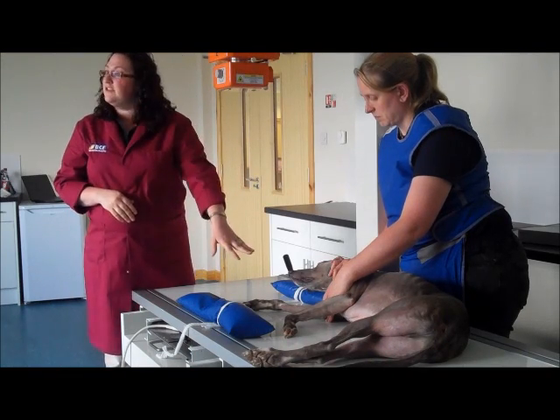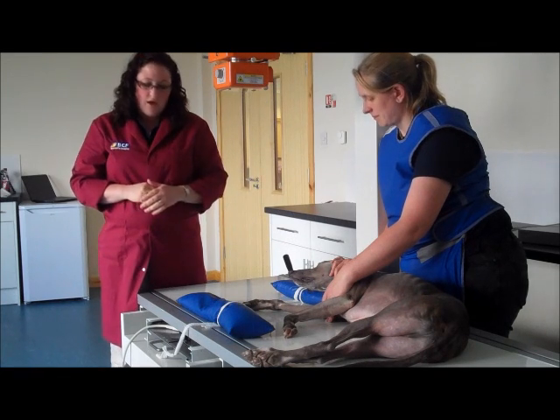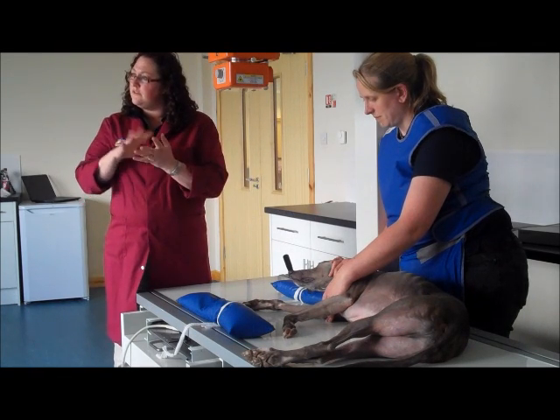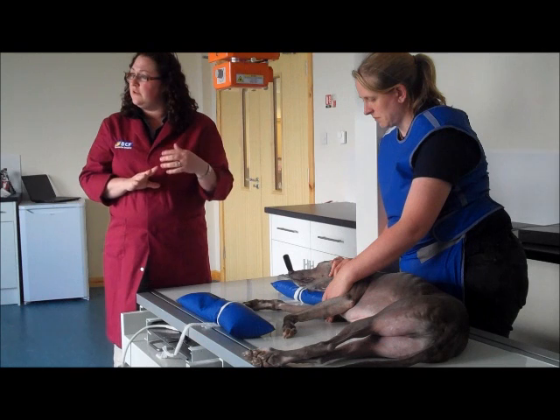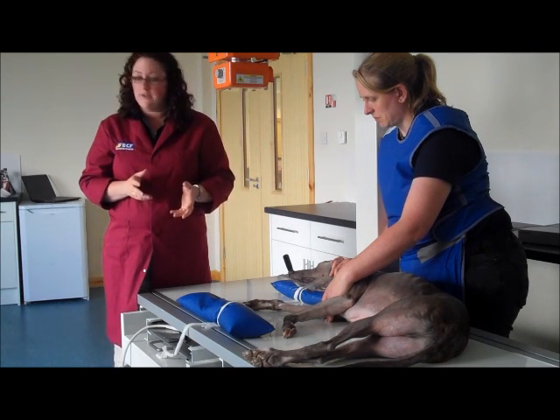So what we'll do is we'll have the patient in lateral recumbency — in this case right lateral — and what we'll actually be looking to do is just to spread the digits apart so that we can evaluate P1, P2, and P3 individually on each of the digits.